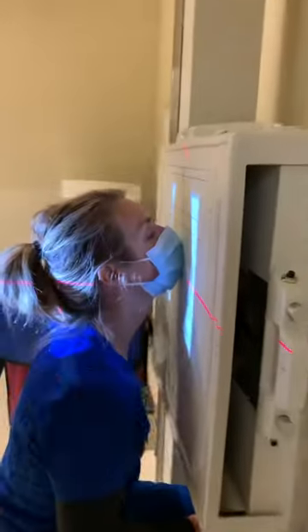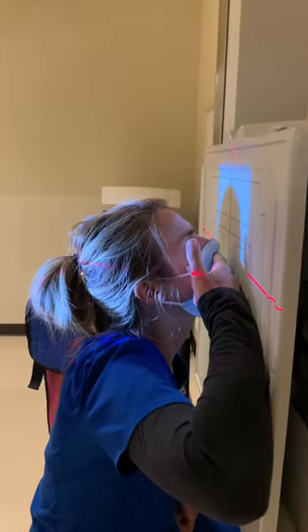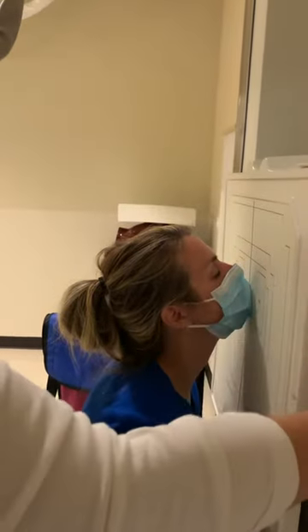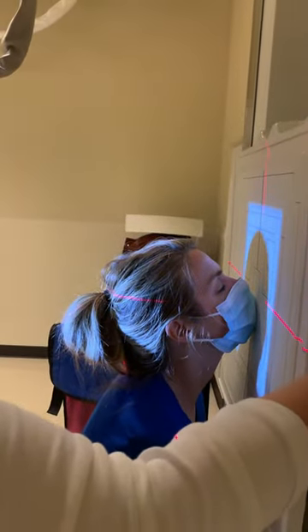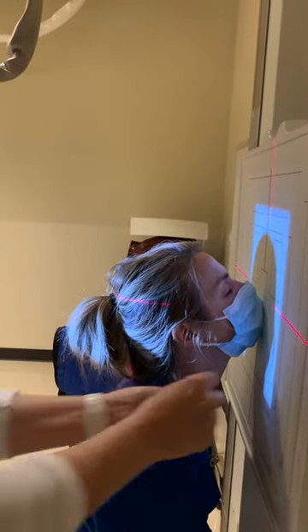Can you do it with your right hand? Our OML should form 37 degrees to the IR, which would make our MML perpendicular.